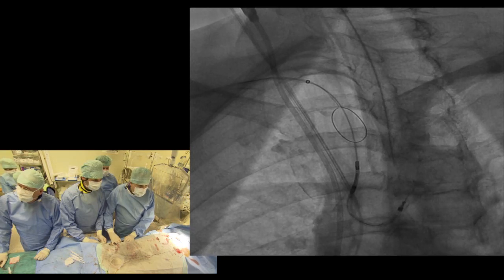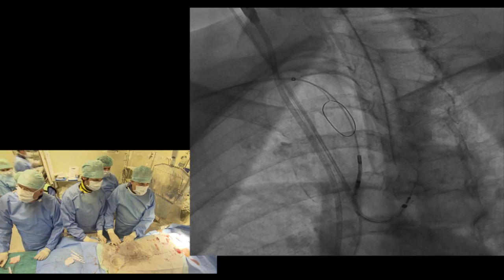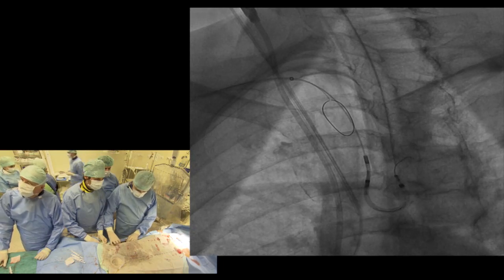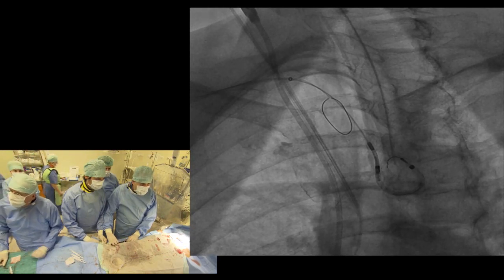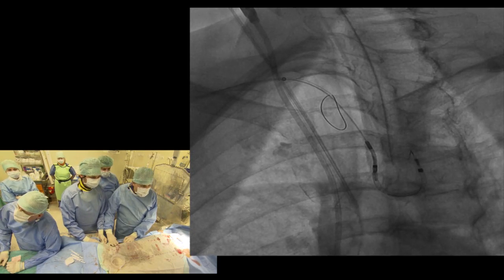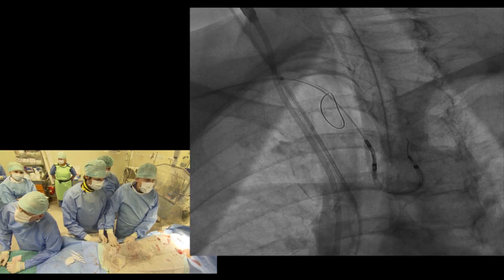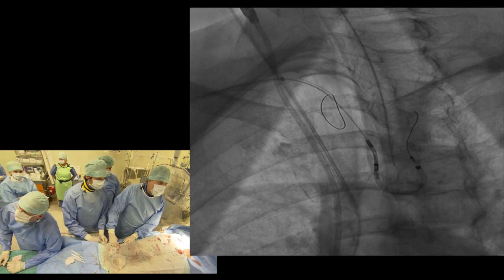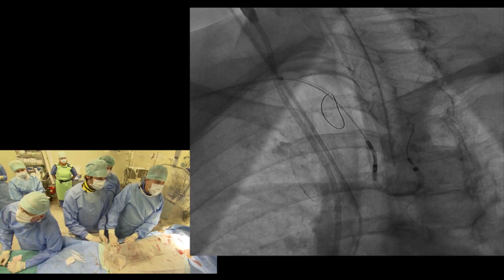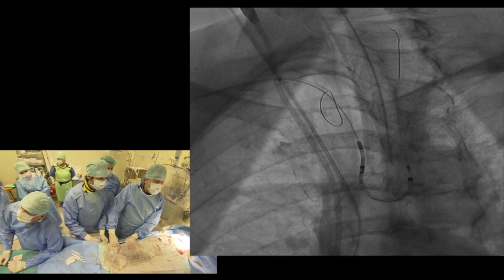It's too much curve. Maybe like this and like this now. No. Okay, like this. No. Try like this. I will go up with everything. But it is too much curve, I know. It's going somewhere or not? Yes, it is subclavian, I suppose. You think so? It is subclavian. So maybe more curve on it. It's too much, like this. Yes. Now we are.